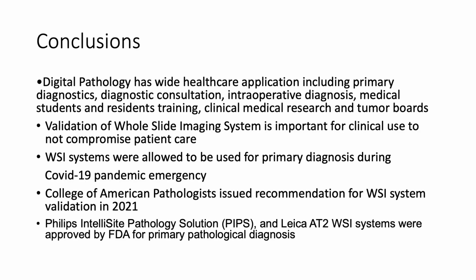So in conclusion, digital pathology has wide healthcare application, including primary diagnostics, diagnostic consultation, intraoperative diagnosis, medical student and resident training, clinical medical research, and tumor boards. Validation of whole slide imaging systems is important for clinical use to not compromise patient care. WSI systems were allowed to be used for primary diagnosis during the COVID-19 pandemic emergency. The College of American Pathologists issued recommendations for WSI system validation in 2021. Philips IntelliSite Pathology Solution and Leica Aperio AT2 WSI system were approved by FDA for primary pathological diagnosis.